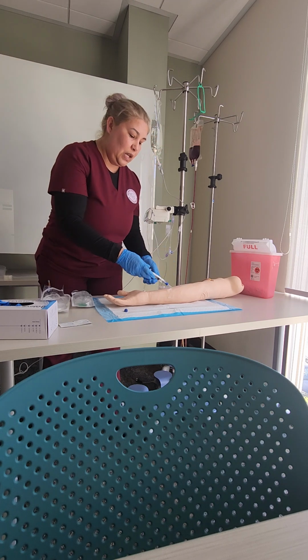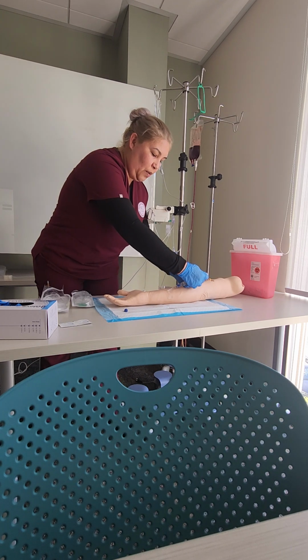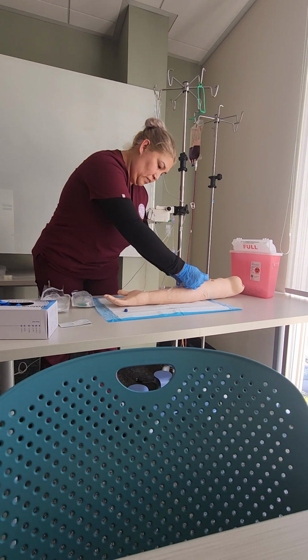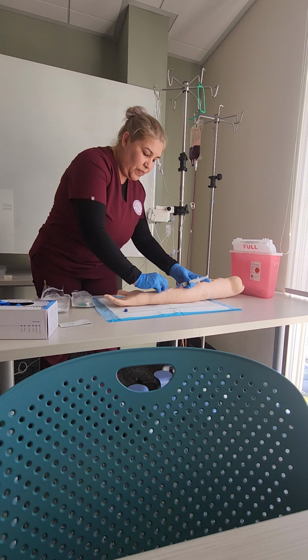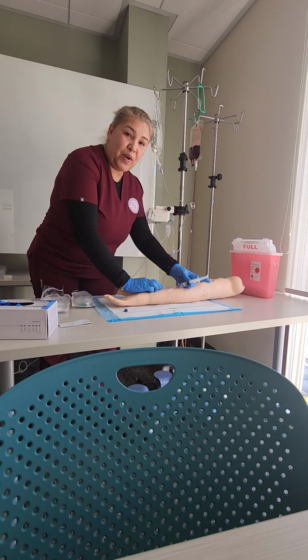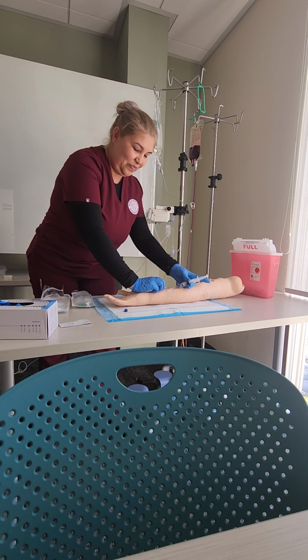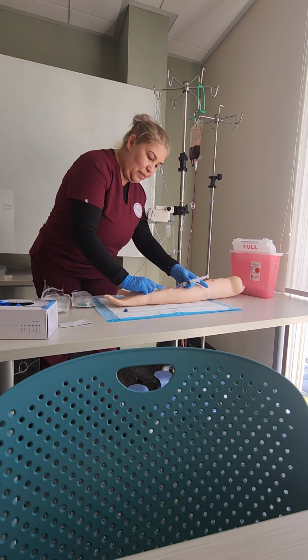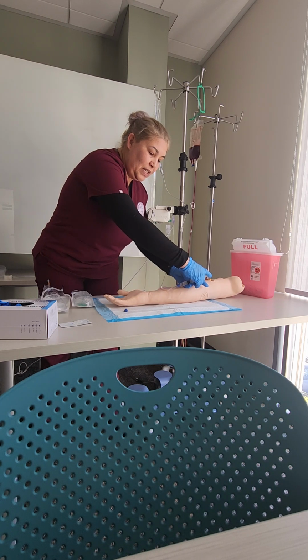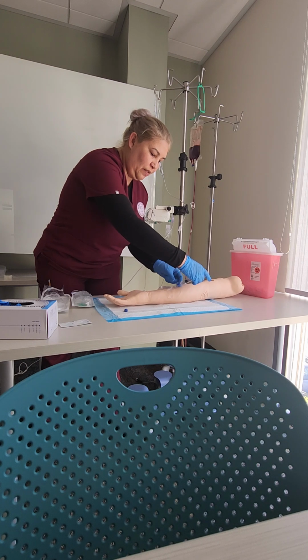Make sure it's tight. So what I want to do is draw back, make sure I get blood return. Okay, and now I did get blood return. I want to make sure I unclamp it also. Okay, I want to try to get blood return. Yep, there's the blood return. Now that I see that, I know it's a good IV. It's still working. I'm going to flush. Perfect.